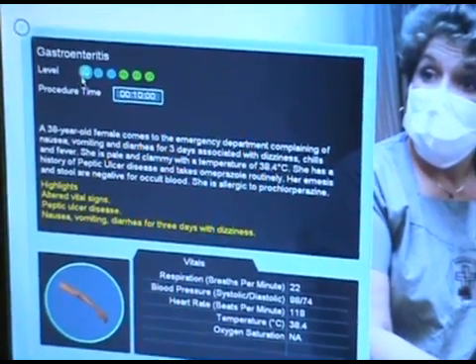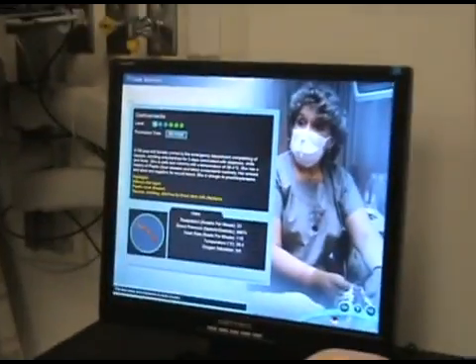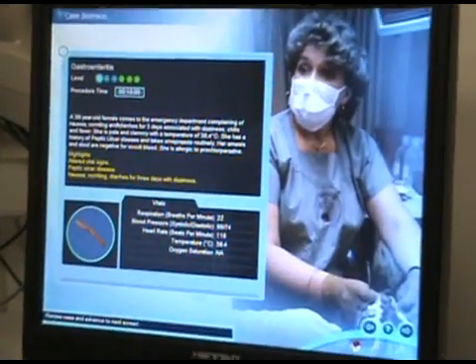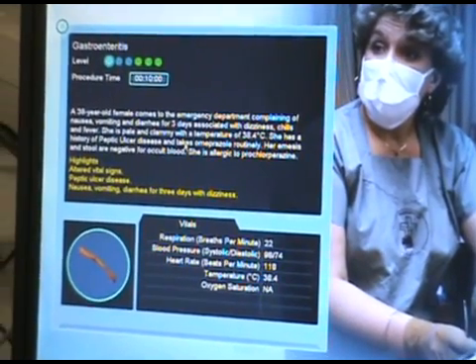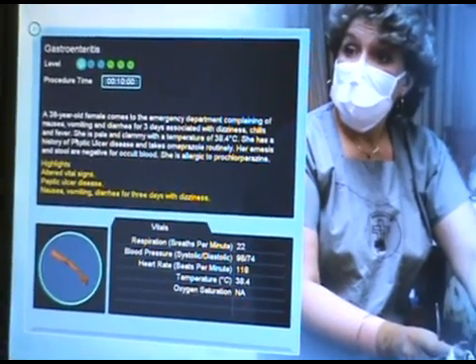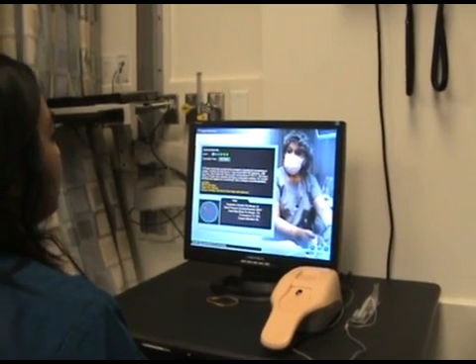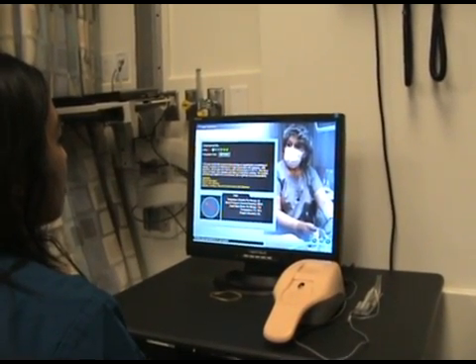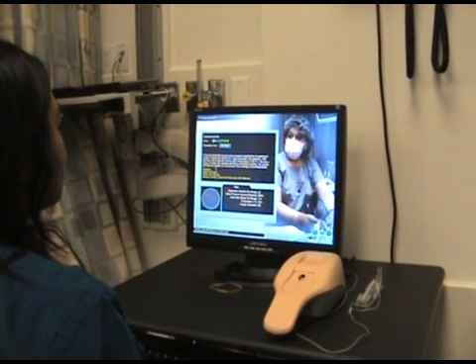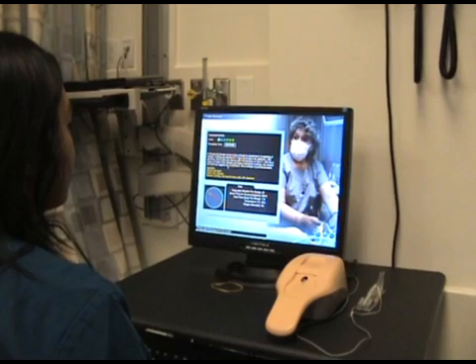This is a student level one gastroenteritis. I have 10 minutes. A 38-year-old female comes to the ER complaining of nausea, vomiting, and diarrhea for three days with dizziness, chills, and fever. She's pale and clammy and her temperature is 38.4. History: peptic ulcer disease, and she takes omeprazole routinely. Her vomit and stool are negative for blood. She's allergic to prochlorperazine.